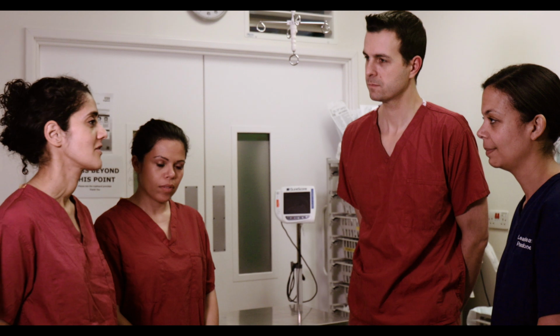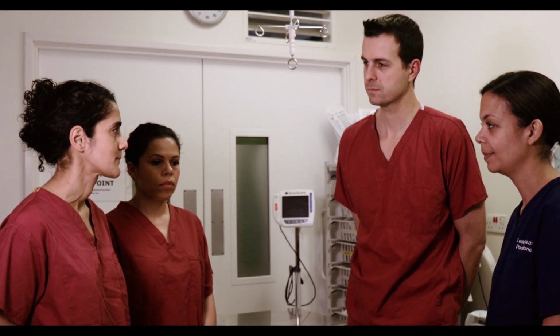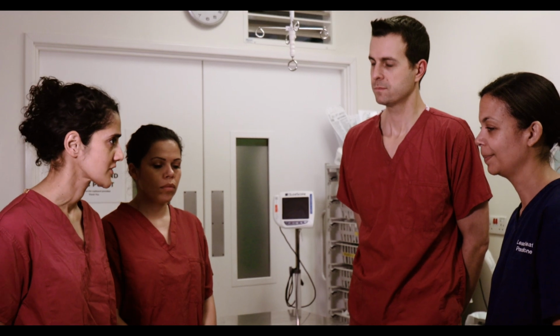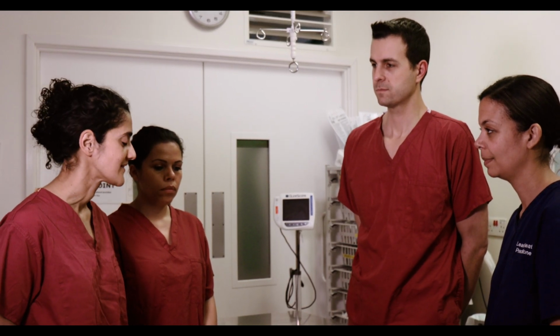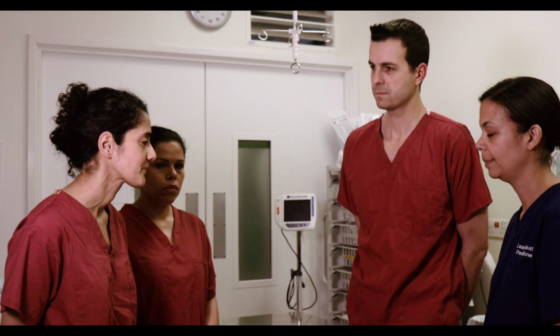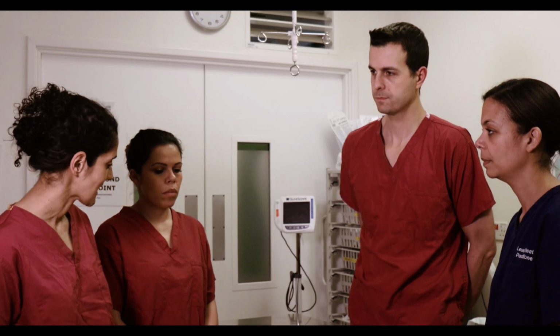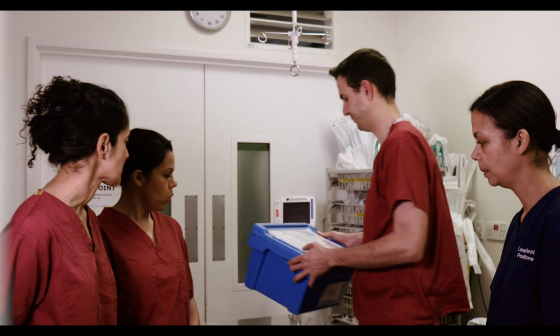Just to recap the scenario, this is a 59-year-old gentleman who's come in with suspected COVID-19. He's got increasing oxygen requirements. His SATs are now 88%, and I think there's a consensus on ITU that we're going to intubate him, which we'll need to do with all PPE in place. I think Max has got our box, so we can start working through our checklist.